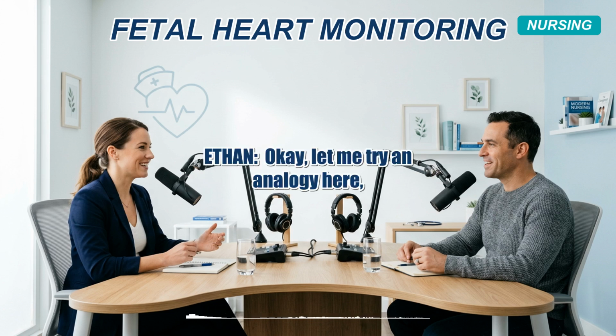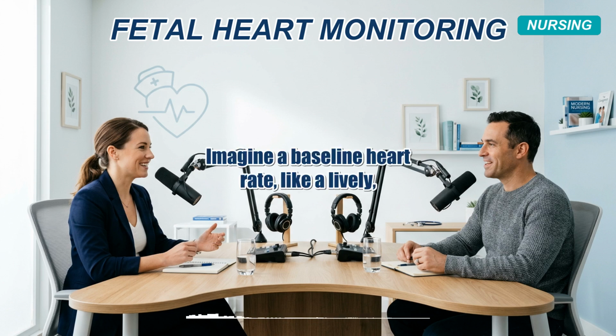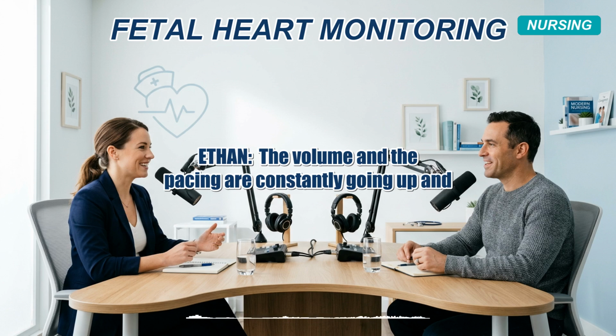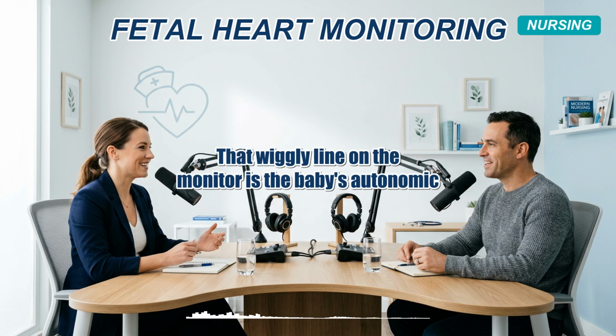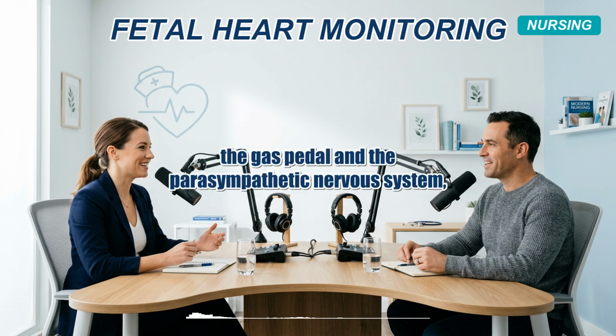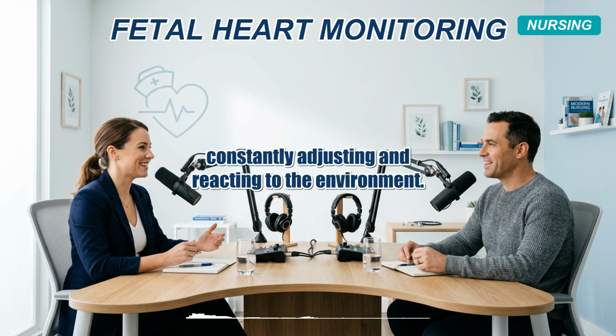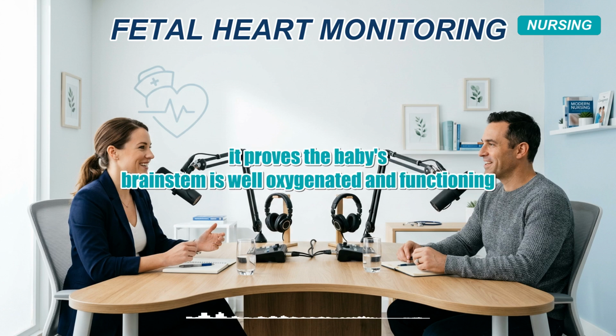Okay, let me try an analogy here to make sure I'm grasping this. Imagine a baseline heart rate like a lively, engaged conversation at a dinner party. Okay, I like that. The volume and the pacing are constantly going up and down as people react to each other, right? That wiggly line on the monitor is the baby's autonomic nervous system having a lively conversation. Yes, perfectly said. It's the sympathetic nervous system, the gas pedal, and the parasympathetic nervous system, the brake, constantly adjusting and reacting to the environment. That is a perfect way to visualize it. If the line is wiggly, it proves the baby's brainstem is well oxygenated and functioning beautifully.